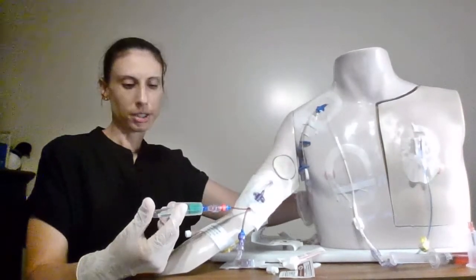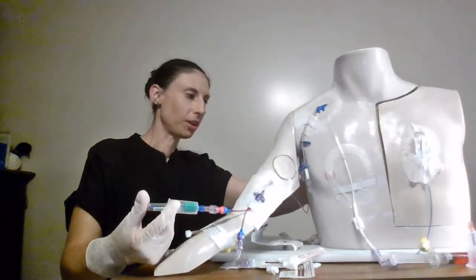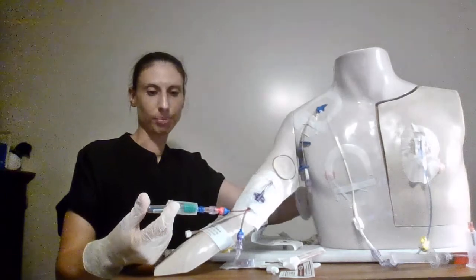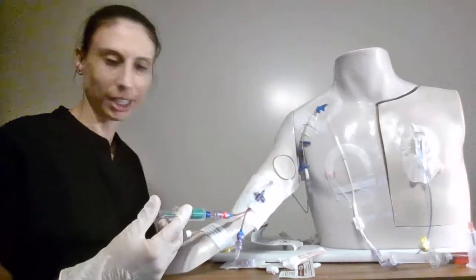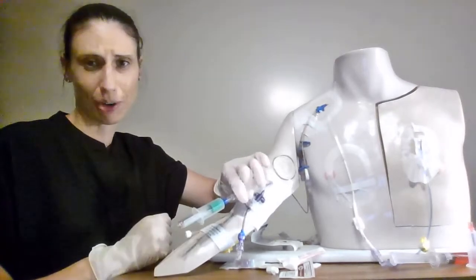However, PICs can be a little bit finicky because they're so long that sometimes they won't give you the blood that you need. Okay so if this happens to you in the lab you can just verbalize what would happen. You can see my container is not filling up.